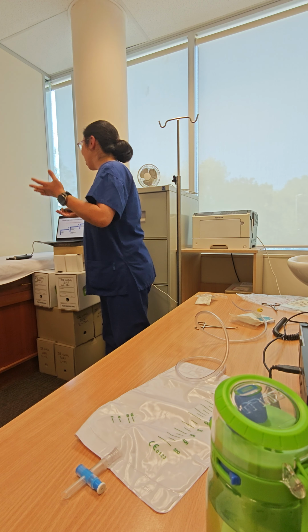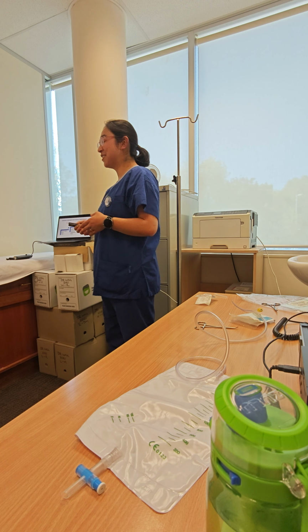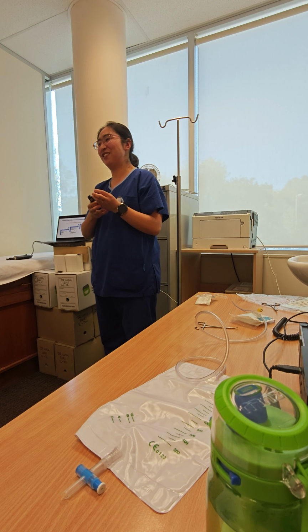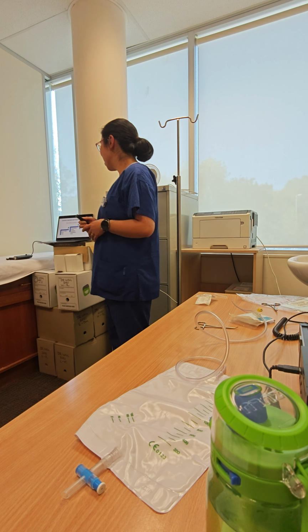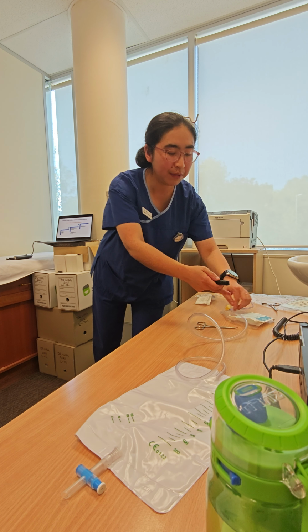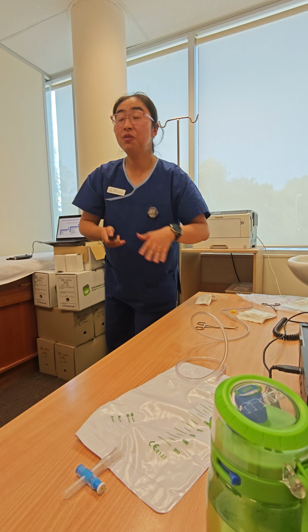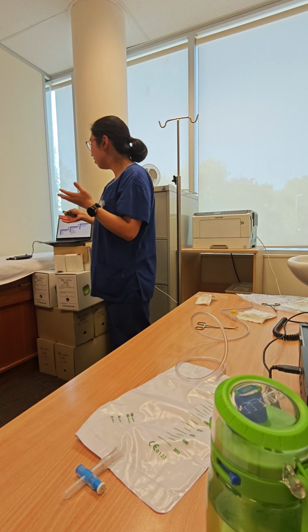Also, for the gloves and sterile problems, I have been advised twice. I have to wear gloves before I touch all the things for the patients. And also for the sterile part, especially when you open this stuff, make sure it's in the middle of the gauze, not just in the packs. Yeah, so those are all the details that make the decision on whether it's a good one or not.